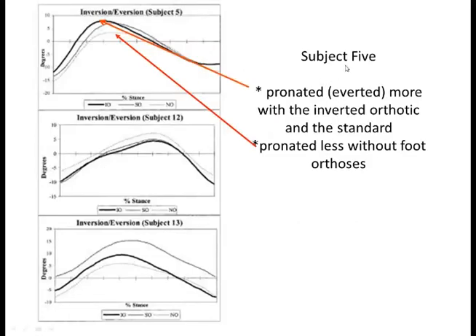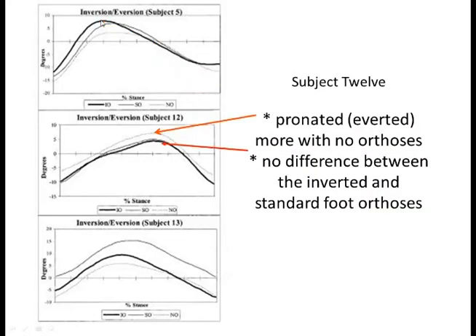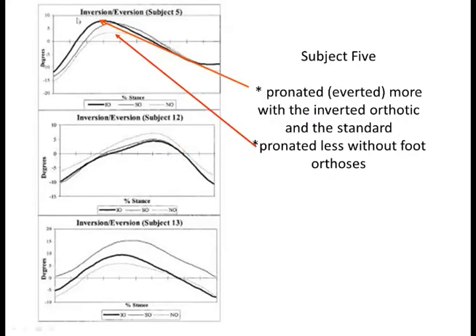So here's what people are talking about. Subject number 5, and you can see here that this black solid line is the orthotic that worked, and you can see maximum pronation there is probably around 7 or 8 degrees. The orthotic that didn't work, maximum pronation looks to be around 5 degrees, and no orthotic, maximum eversion I should be saying, around 3 or 4 degrees. So the foot orthotic that worked everted or pronated the foot even more than the orthotic that didn't work, and no orthotic. But also notice, maximum eversion, around just below 40% of the stance phase.